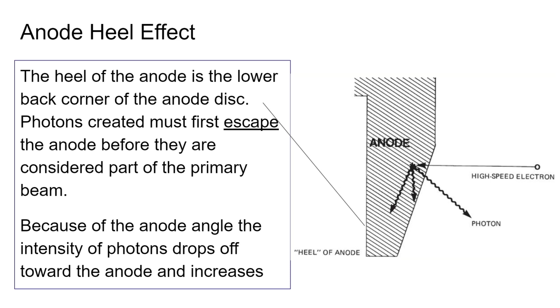So there's sort of a spectrum down here. Whereas you might see this kind of like this here, where we have anode over here and cathode over here. And your radiation gets higher as you go towards the cathode and lower towards the anode.